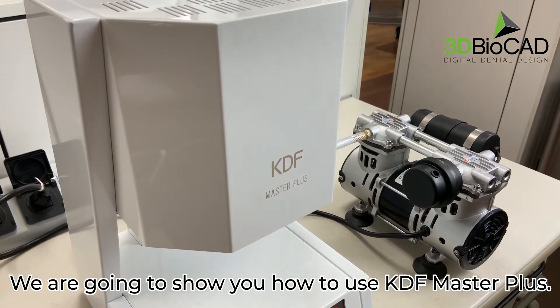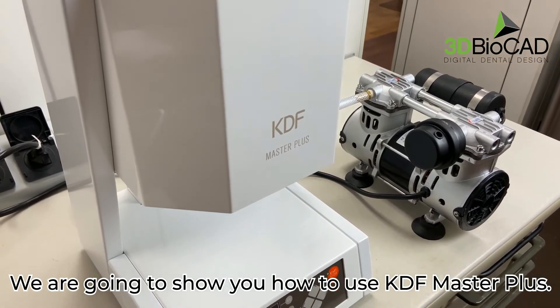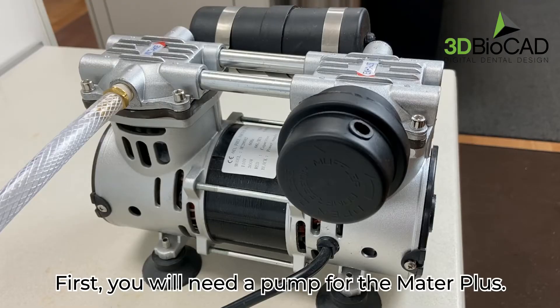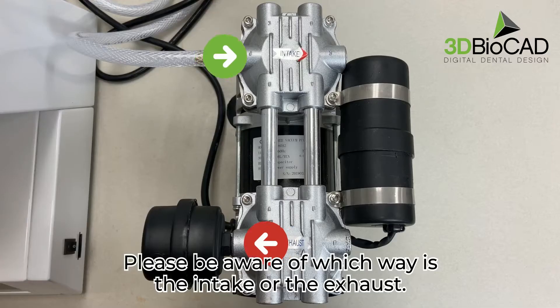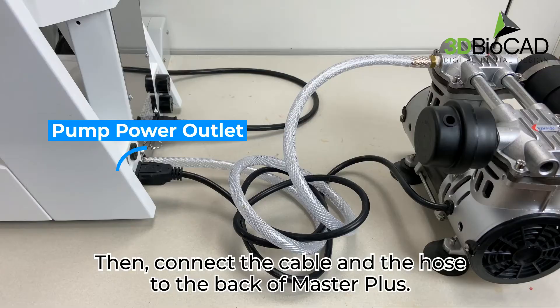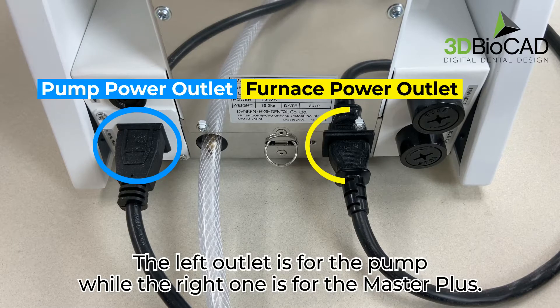We are going to show you how to use the KDF Master Plus. First, you will need a pump for the Master Plus. Please be aware of which way is the intake or the exhaust. Then, connect the cable and the hose to the back of the Master Plus. The left outlet is for the pump while the right one is for the Master Plus.